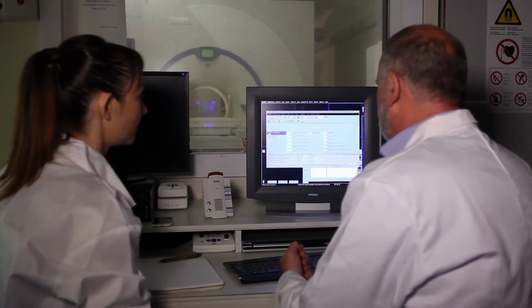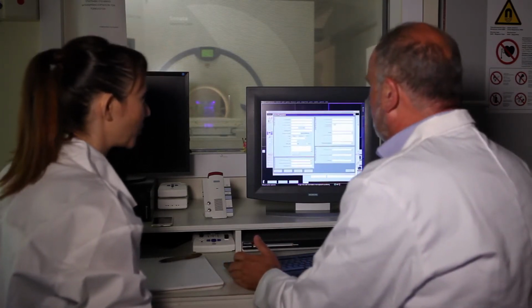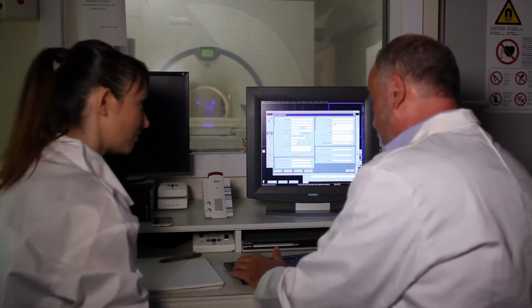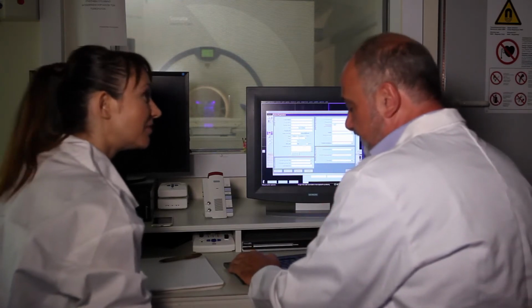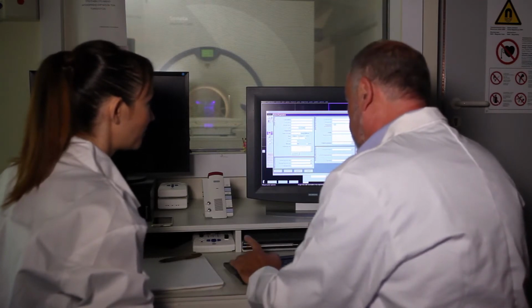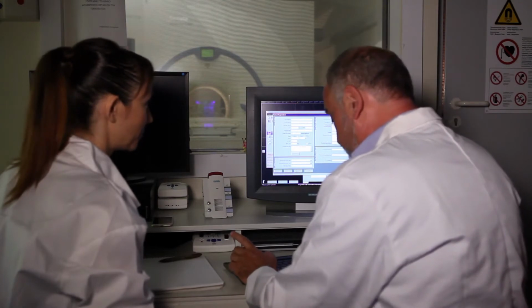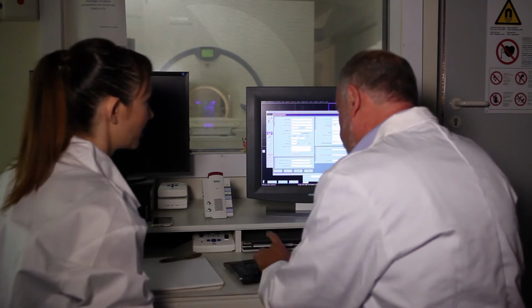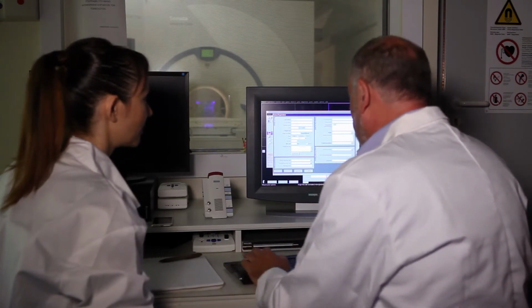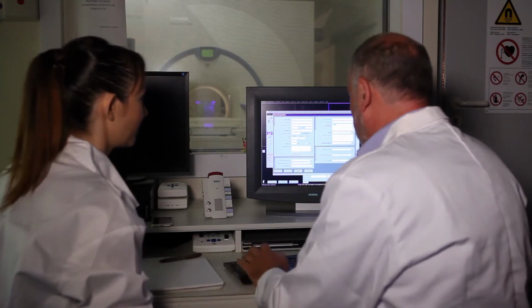So, first of all, we're going to register the patient, and our patient is a phantom. That's good, okay. We use the reverse date as a code, as an example, to keep track of the date, exactly. So we got 2017, and we got today's 30th of June, which means 6 months, 06, 30. We call it ACR, which is the phantom, and of course this is a QA protocol, okay, QA MR.